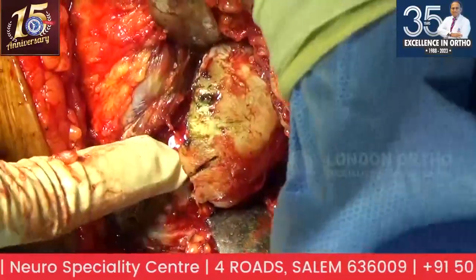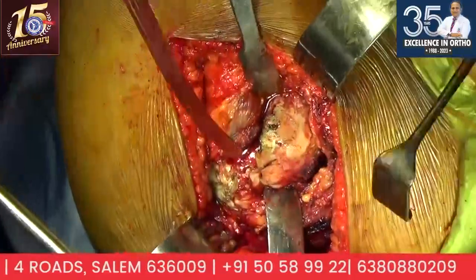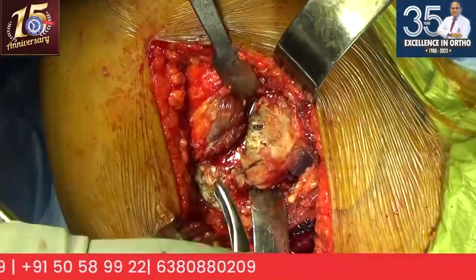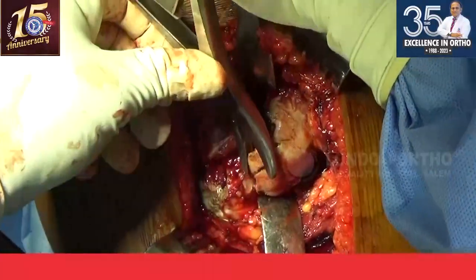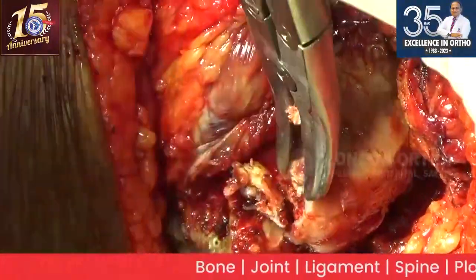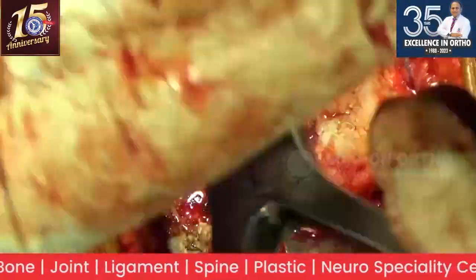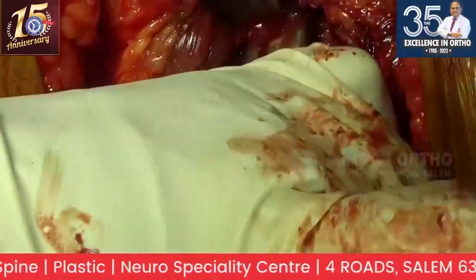So I don't need to remove the vastus lateralis even in this case. Nibbler, please. If I had difficulty, I would have chiseled off this anterior osteophyte before dislocating it. But this came fairly easily. So I am going to do a very low neck cut to the level of the lesser trochanter. What would be the consequences of that can be discussed now.